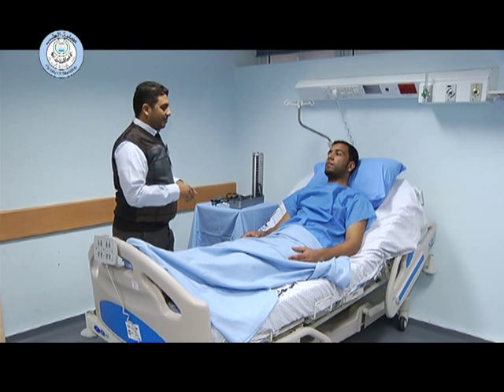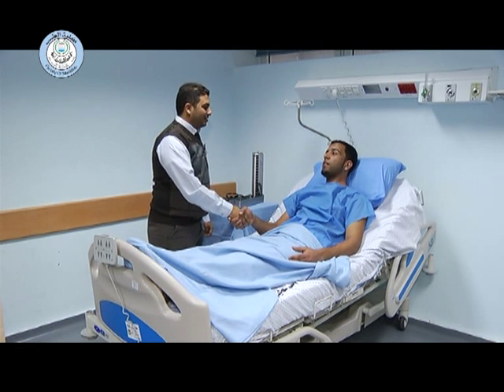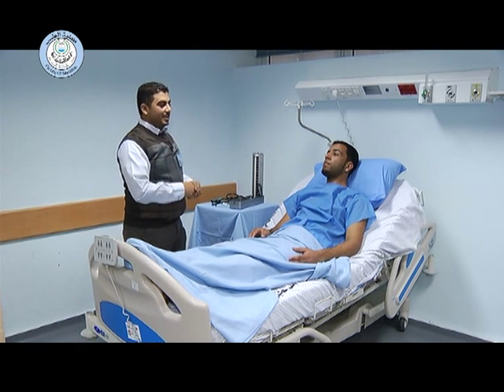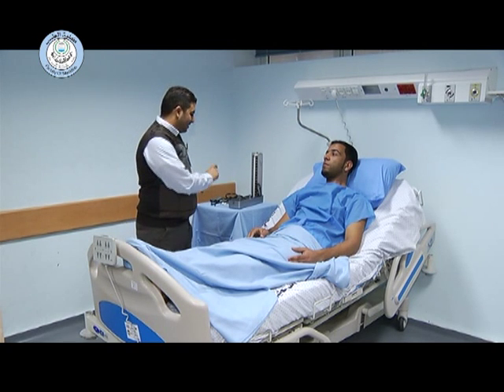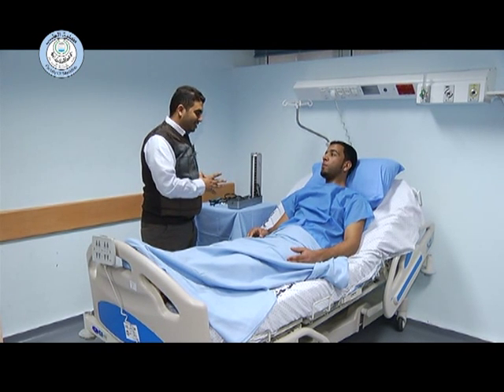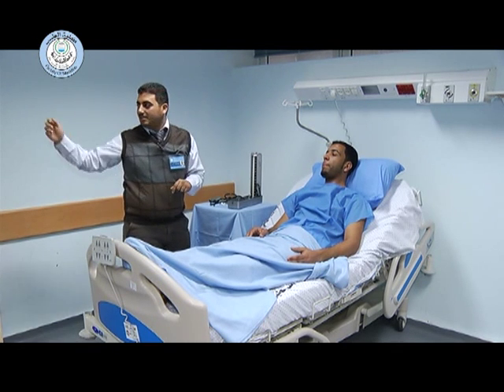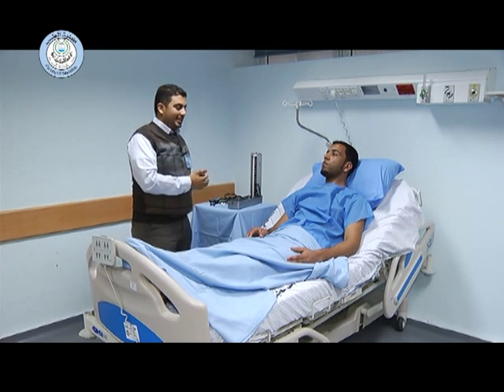First of all, we have to introduce ourselves to the patient. Then we have to take permission from the patient to perform this clinical skill. After that, we have to ensure privacy for the patient by closing the curtain, and then we have to wash our hands.